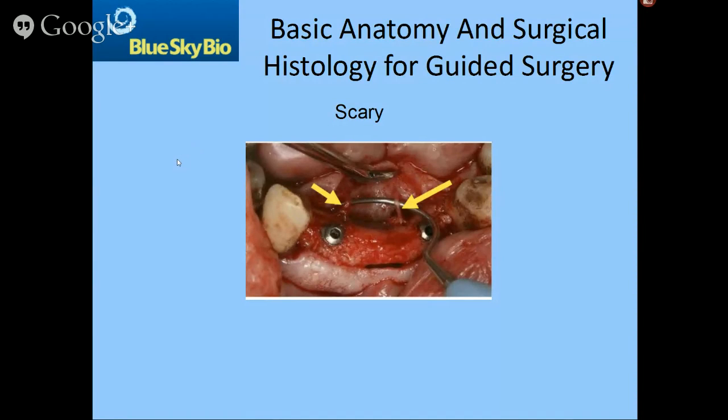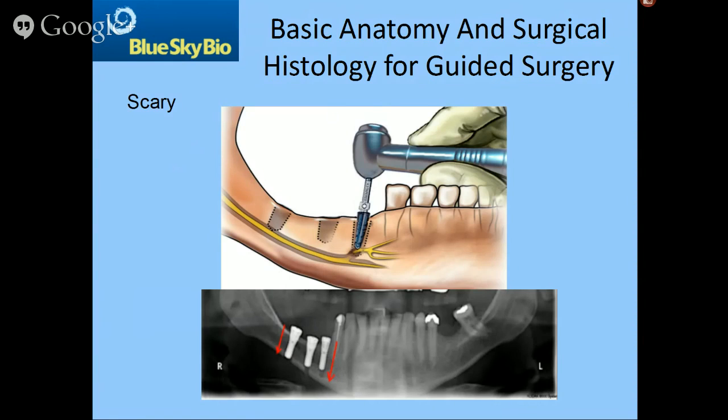And so it's scary. There are blood vessels that you may or may not be aware of, and if you're not really good at or comfortable with dental anatomy on a cone beam or a CT for that matter, you may not realize that implant placement near these blood vessels may be somewhat scary and sometimes life-threatening. And so you take a look at it and say, I don't want the responsibility. People who do guides, they're using your guides to do the surgery, and sometimes, if not planned appropriately, how am I sure that I'm in an area where I'm not going to cause the clinician following my guide, or myself and my own guide, to hit a vital structure? What are the areas, and so on and so forth.